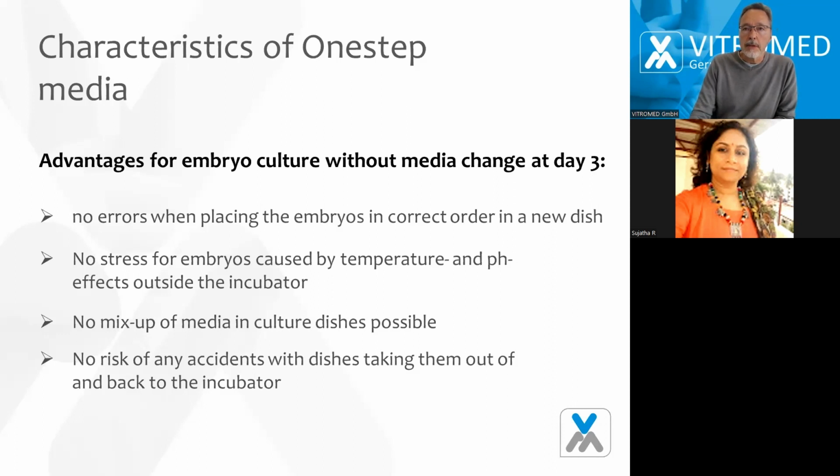Do not have a mix-up of media and culture dishes, like I already said. And there is no risk of any accidents with dishes, taking them out of and back to the incubator. In really bad cases, it can happen that one dish falls down on the bottom, and then everything is lost. This risk is reduced because you don't have to take out the dishes so often with a one-step medium.